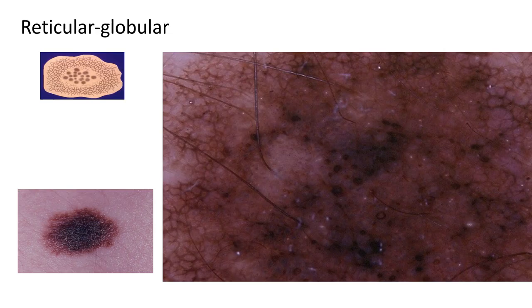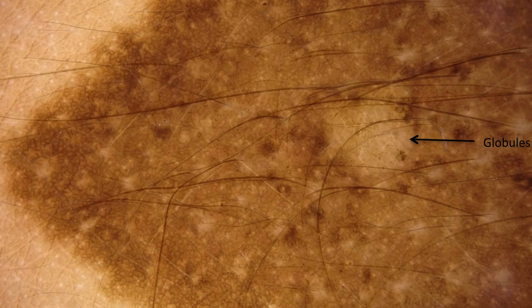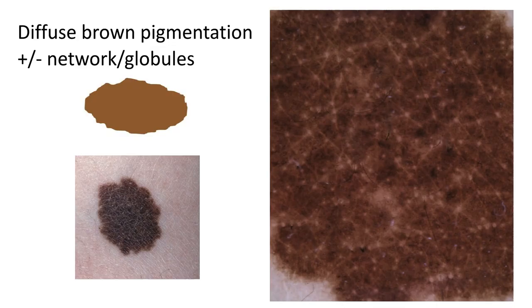Another example of these angulated brown cobblestone globules. The reticular-globular pattern most frequently is seen with peripheral network and central globules, such as this example. Another example of a beautiful small congenital nevus shows peripheral network and in the center small brown globules. Here we see a predominantly reticular pattern, but in the center a small collection of cobblestone globules.